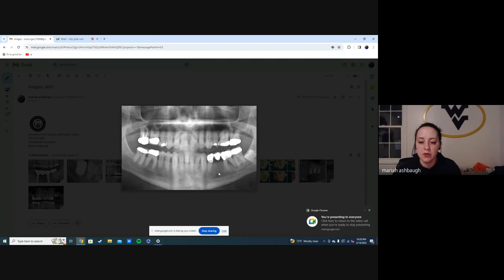So for this particular patient, it looks like they opted for a bridge. So this is floating like a bridge would be. So you shave this tooth down, and then you do a 3-unit bridge.